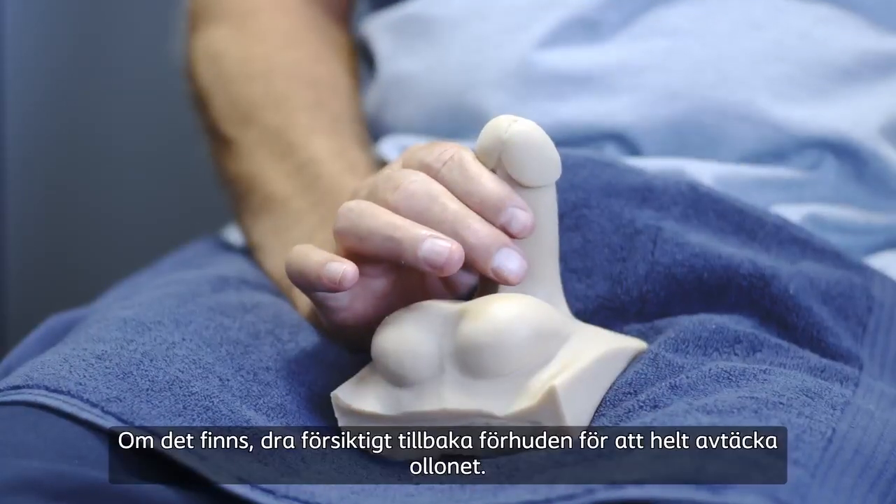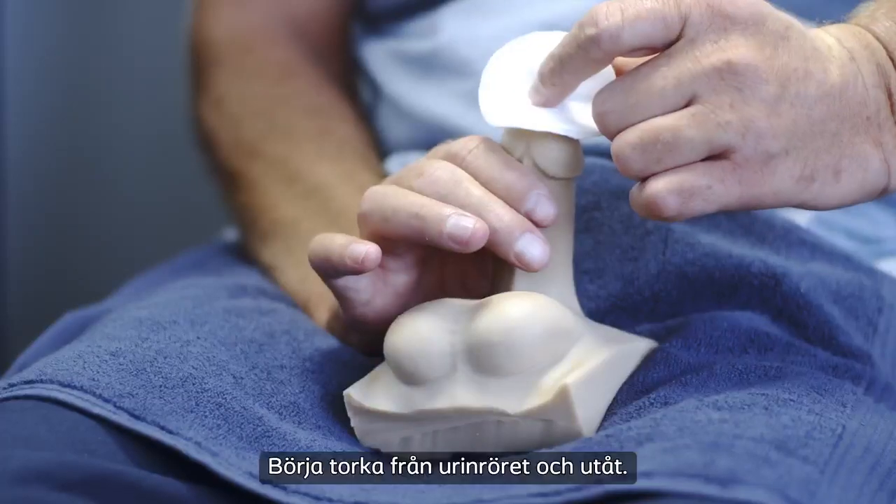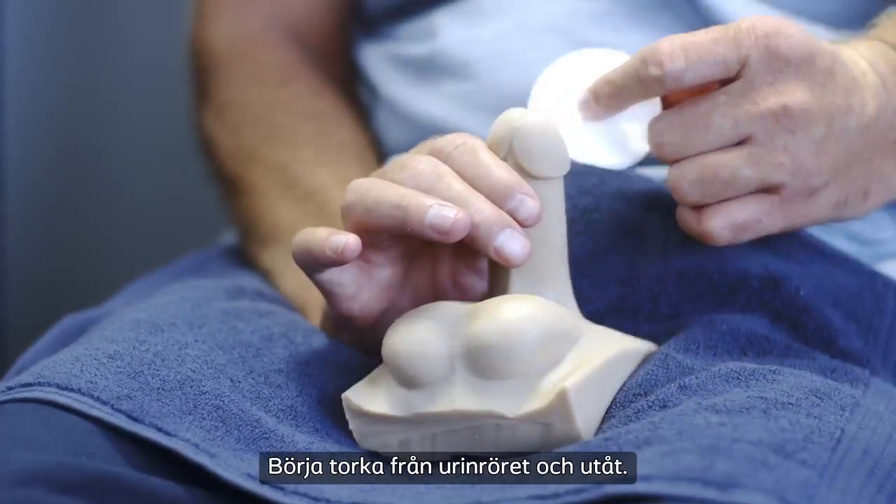If present, gently pull the foreskin back to completely reveal the head of the penis. Start wiping from the urethra and outwards.